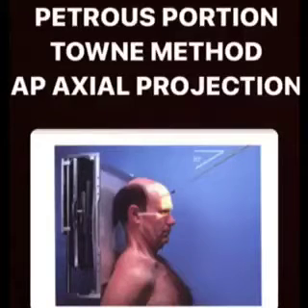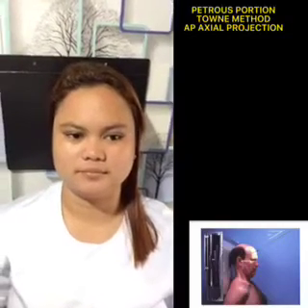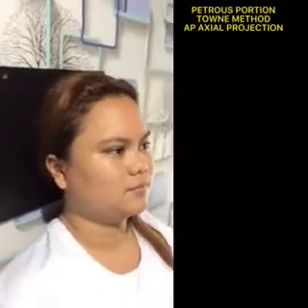And the last one is the AP axial projection, Towne method. Patient position. Place the patient in either the supine or seated upright position. Center the midsagittal plane of the body to the midline of the grid device.